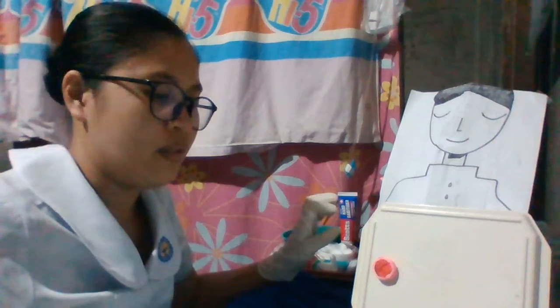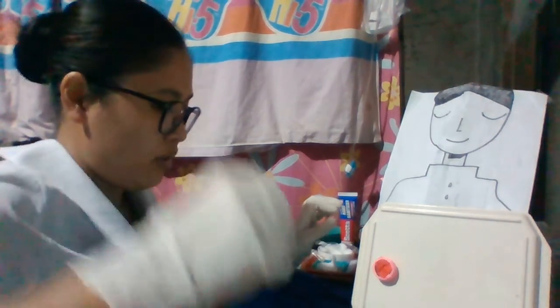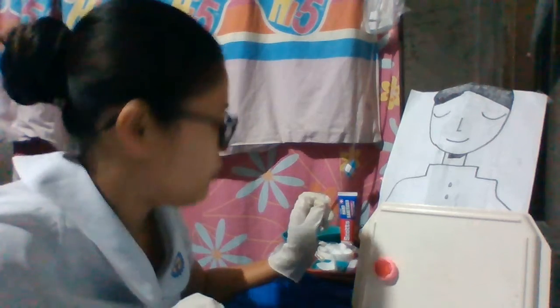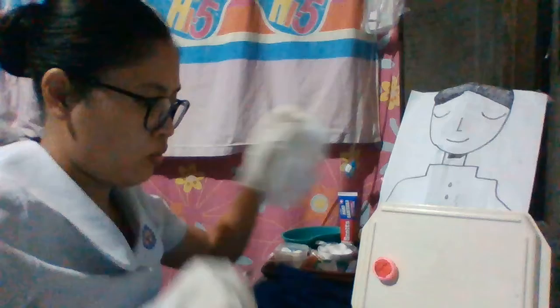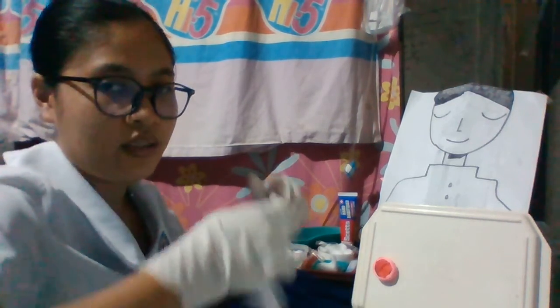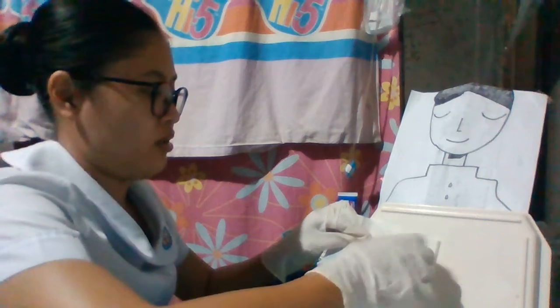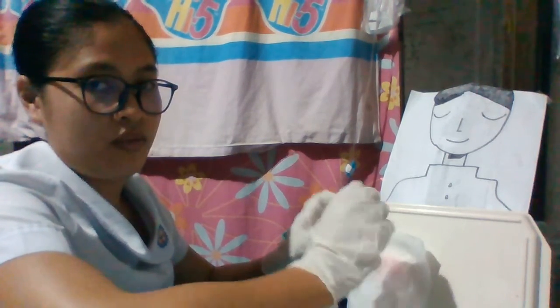We're doing this because sometimes the skin barrier may be left in place if the colostomy pouch has a detachable faceplate. Then we're going to place a piece of tissue or loose pad over the stoma to protect it, and we're going to change it if necessary.